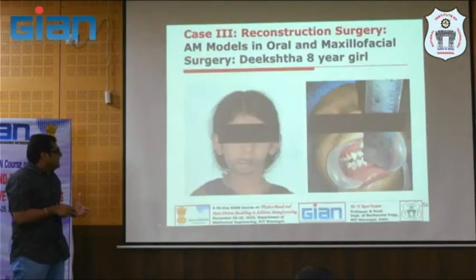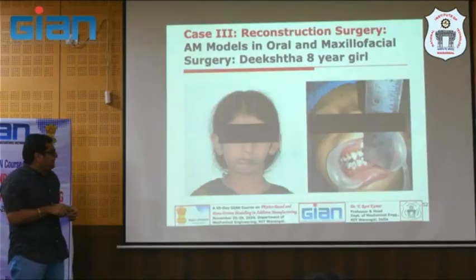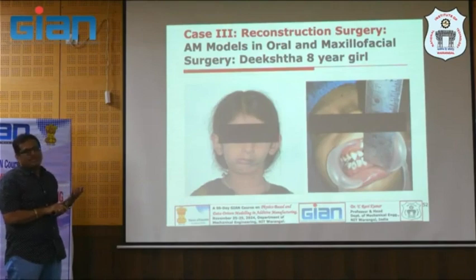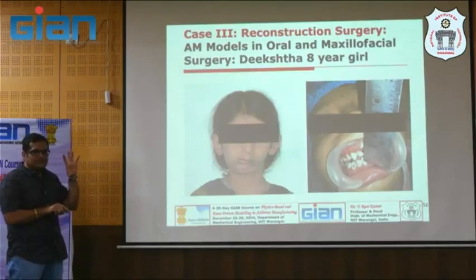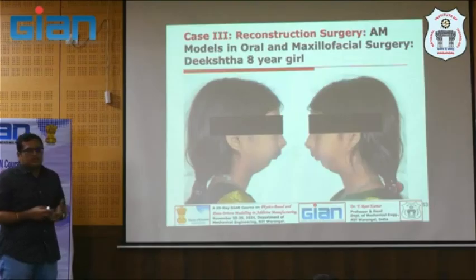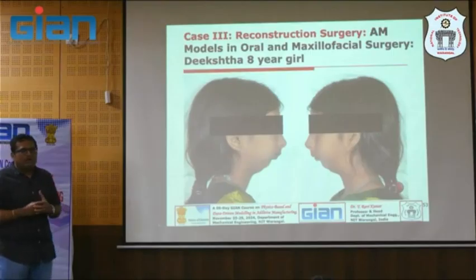And another case study, it's a mandibular distraction osteogenesis. By birth she had asymmetry, or the bone is not grown proportionately. That's what you can see, the left side and the right side. And because of that she could not open. Normal opening is 5 to 6 centimeters, right? And bone will have its natural growth, and that depends on the age, gender, the family, and then other habits, food habits and all.